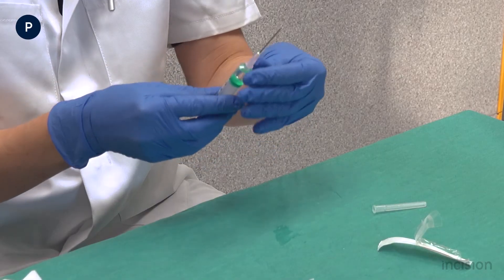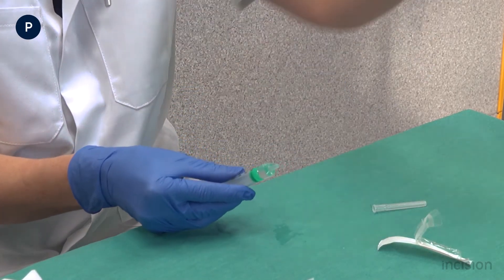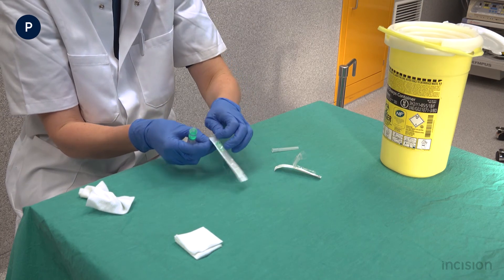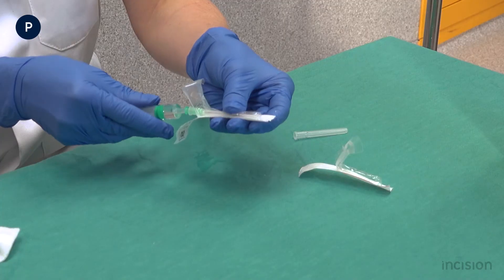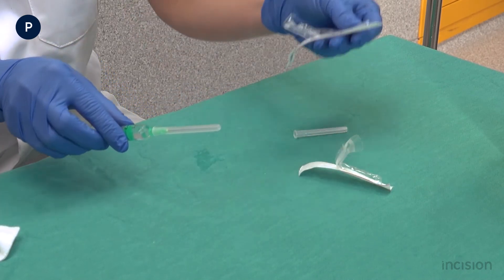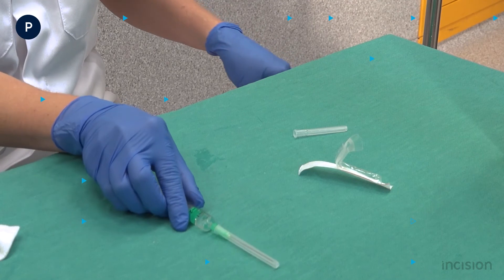The suction needle is replaced with an injection needle. Take note that the injection needles come in different gauge sizes. The smaller the gauge number, the bigger the needle. The most common used gauges for intramuscular injection are 22 to 25 gauge.